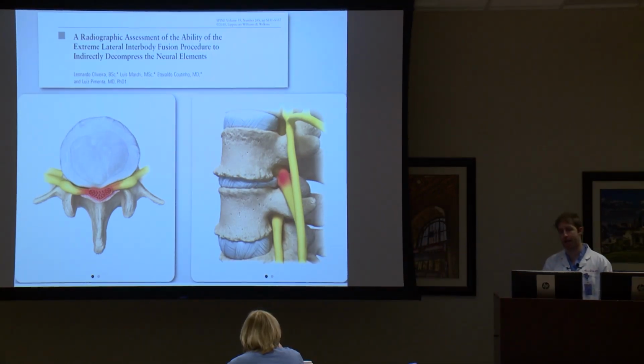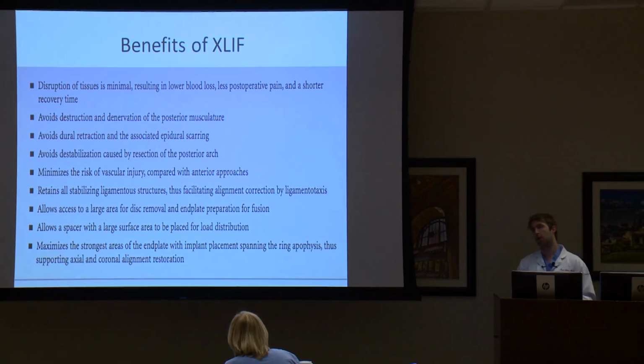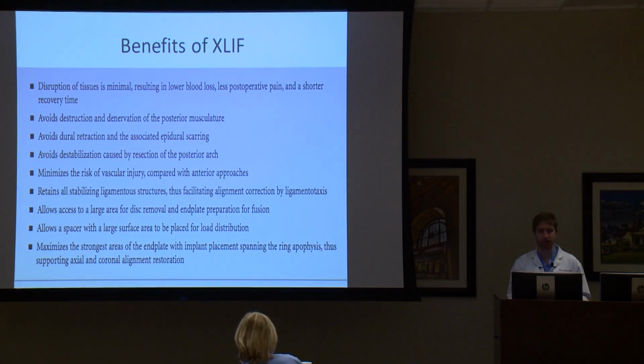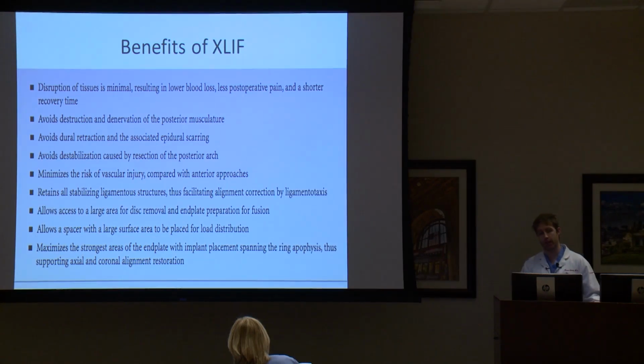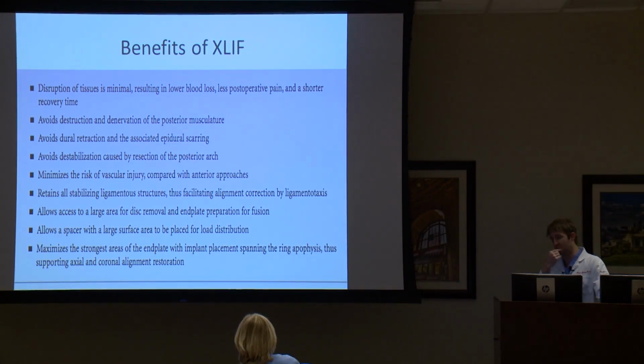And so if you can imagine that, then you can kind of see the idea behind what a lateral or a large cage of any kind would do. I'll try and stay on track and just talk about laterals today. There are multiple benefits of going from the side. You don't disrupt too many tissues. You get a lot lower blood loss, or you should, because you don't have to take down all those posterior elements like most of us who do spine surgery.